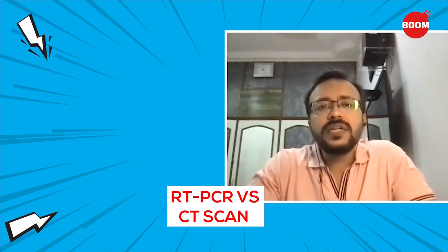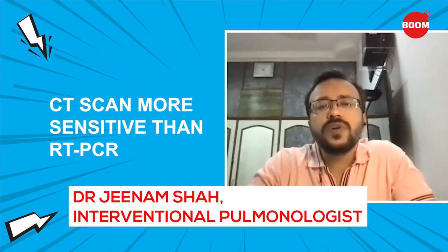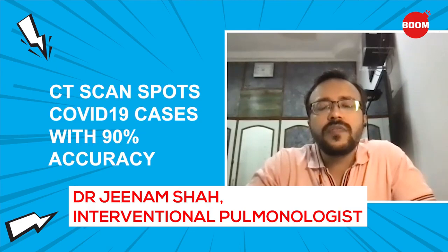But a CT scan is more sensitive. So if I take 100 patients who have COVID and I do a CT scan after, say, day 5 or day 6, I'll pick up at least 90% of the patients who have COVID. So in such scenarios, it is a more sensitive test to determine whether the patient is likely to have COVID or not.